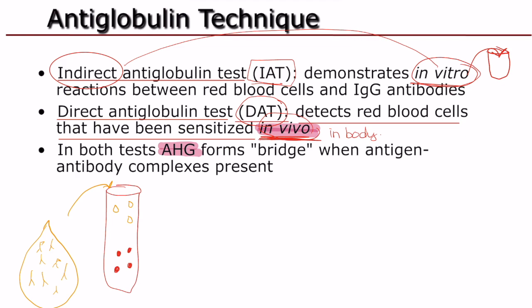There's glucose in there, C6H12O6. There are electrolytes in there. This is straight patient plasma, so all these things are in here. But what we're looking for is we want to see if any of these antibodies in here are going to attach and react with these red blood cells.